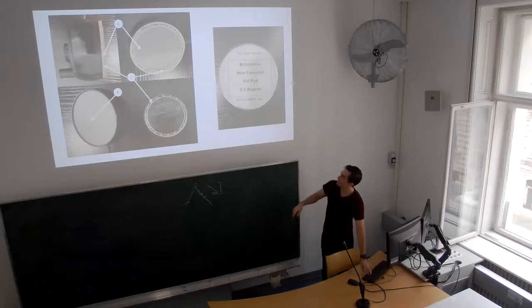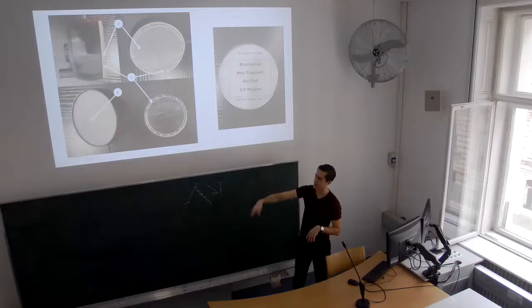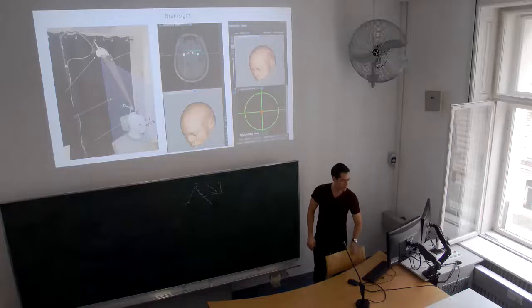This is a modern transducer. There are only a few companies that make this. These are the transducers that you guys have here, for instance. The bottom left is the face of it, where the ultrasound comes out of. We'll often put a little gel pad on it, which makes it easier to affix to the head with no air bubbles. So that's what that looks like.